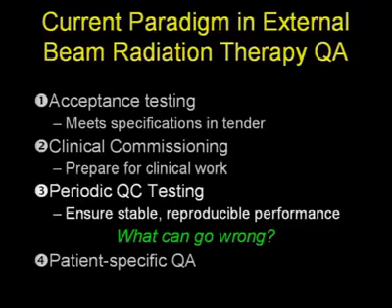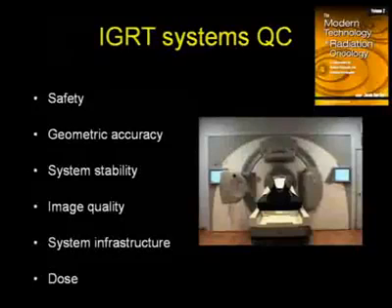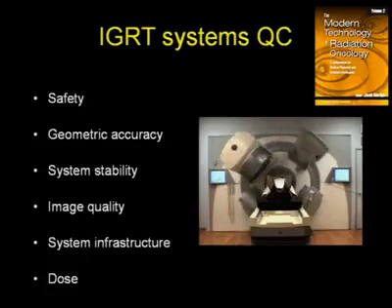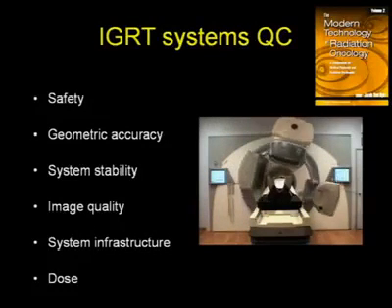So essentially, when initiating a quality control program on new technology, the user or the person who designs this program should keep asking themselves, what is it that can go wrong, and how can I ensure that this parameter or this process does not? So there is some guidance available out in the literature.